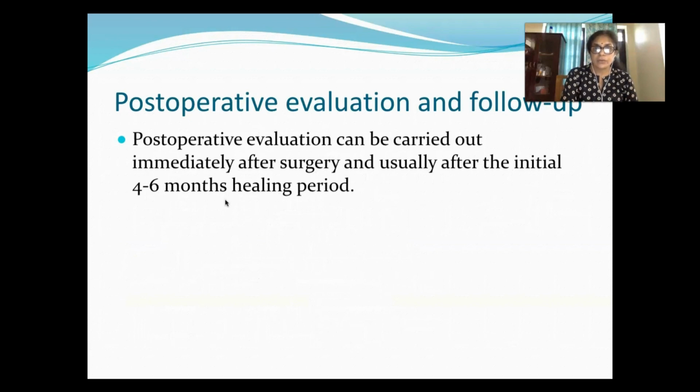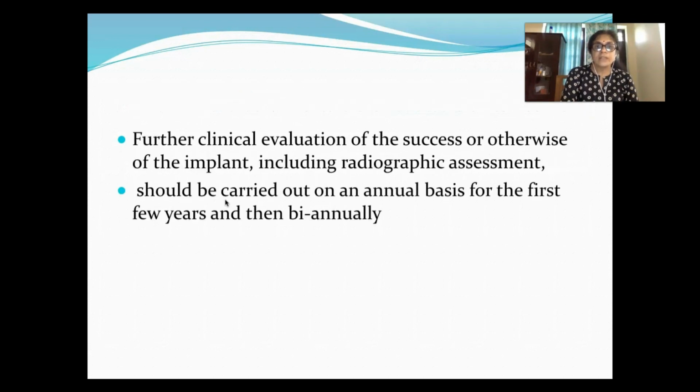Post-operative evaluation and follow-up is also done. It can be carried out immediately after the surgery, and after the initial 4 to 6 months, which is the healing period, evaluation is to be done again. Later on, we can clinically evaluate the success or otherwise of the implant, including radiographic assessment. It should be carried out on an annual basis for the first few years and then biannually.